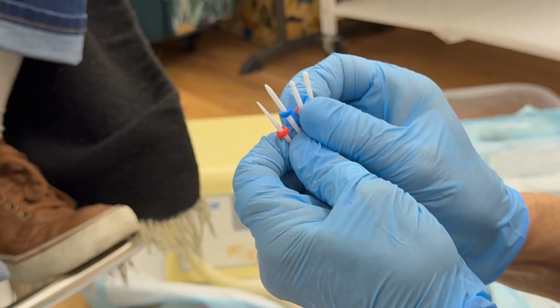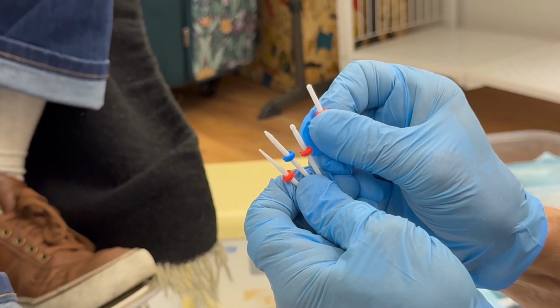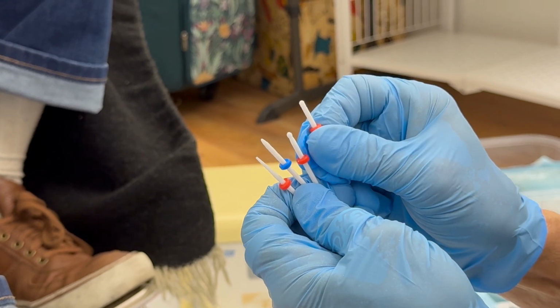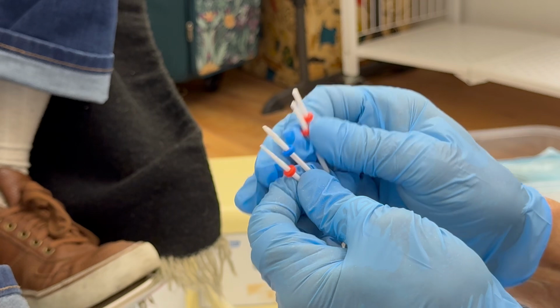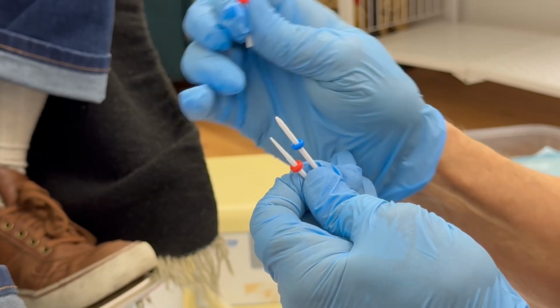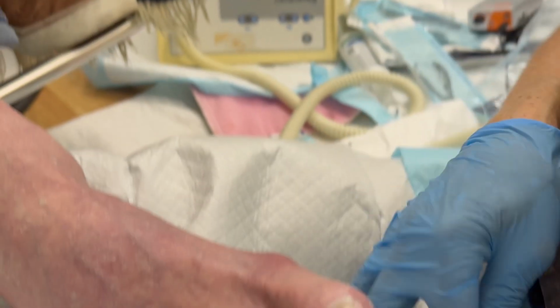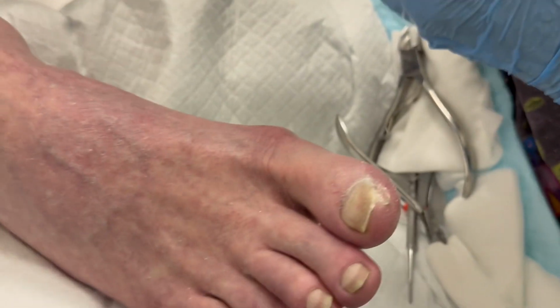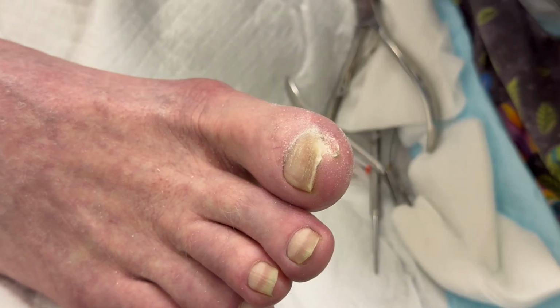So see, I don't know if you can see that, but these are the different tips I've used. I started off with this one, which is more blunt, and that's just to kind of thin things out. This can get into that crevice, which is really good. That one, very pointy, and this one, medium pointy. Sounds like Eddie Izzard. Medium pointy, that's the scientific term, yes. I do believe this is a medium pointy.